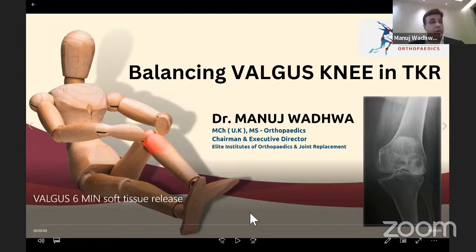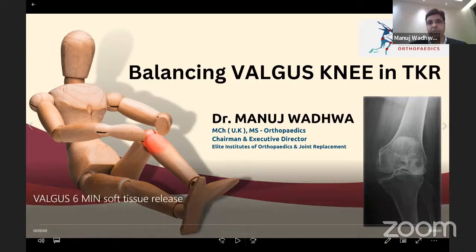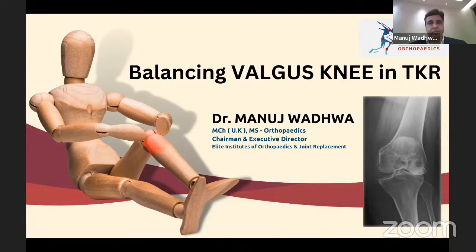So, Shubhranshu, I think you will take it across on the varus very nicely. The first point when I speak about the valgus, I would say to all youngsters, valgus is not just the mirror image of a varus. When Dr. Mohanty speaks to you on the varus, he will sail you through all the releases that happen on the tibial side, while in a valgus, it is the femur which is the main culprit. So we are going to talk about different conditions and how to do a simple balancing in a valgus knee.